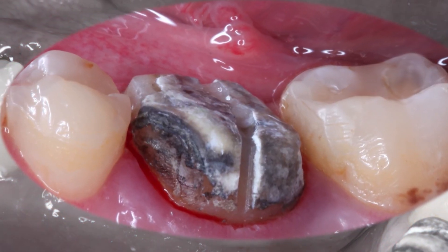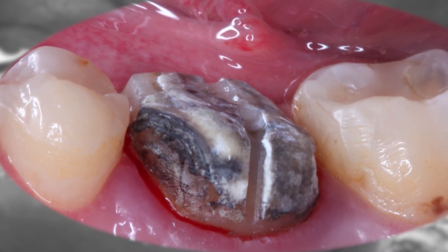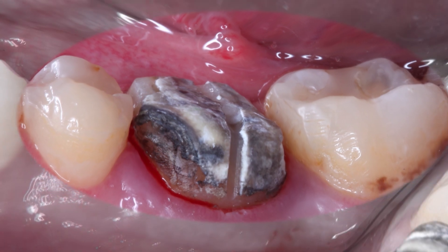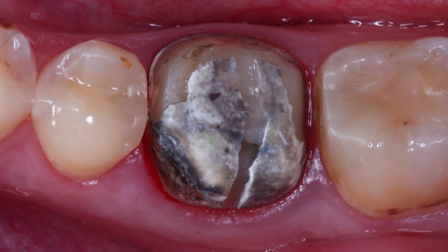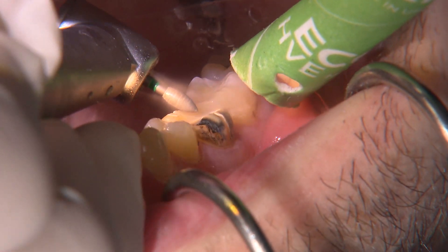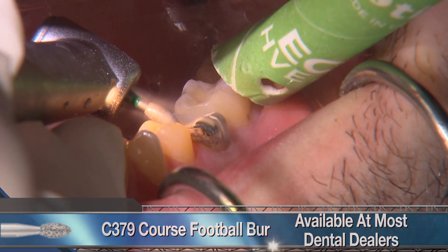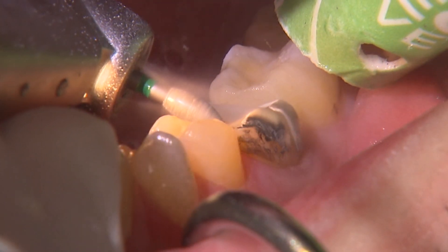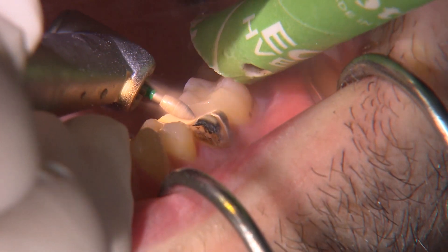From the buccal view of the old prep, we can see the occlusal surface of the prep is almost even with the occlusal table of the adjacent teeth. It'll be important to reduce this further to allow adequate room for our Bruxer crown. I begin refining the preparation on the occlusal using a coarse grit football diamond with the tip slightly angled downward to ensure the central fossa area is deeper, allowing for more natural contours of the crown.